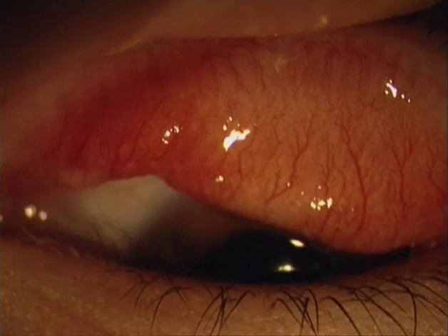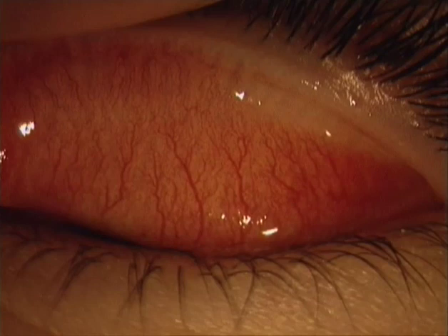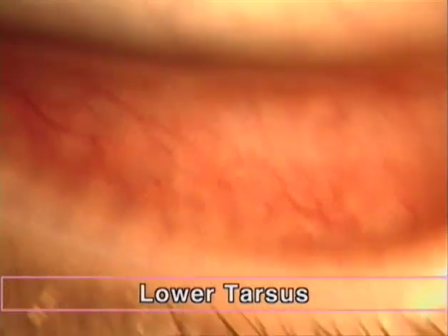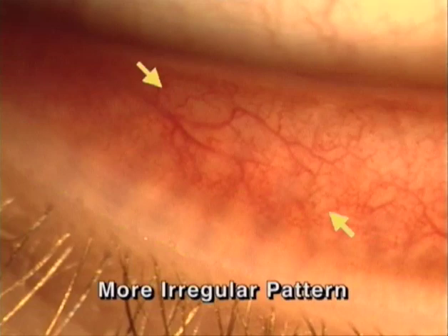Note: in the everted lid, beyond the nasal end of the tarsus, is a small section of conjunctiva that actually belongs to the upper orbital part of the conjunctiva. And this occurs also beyond the temporal end of the tarsus. In the lower lid, the tarsus is much shorter, and the vascular pattern is less regular.